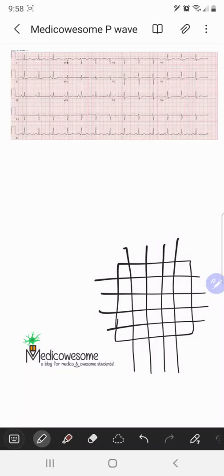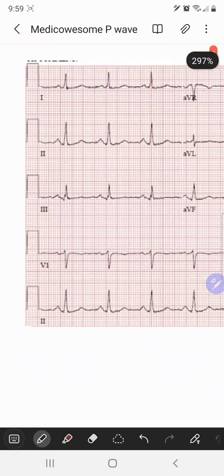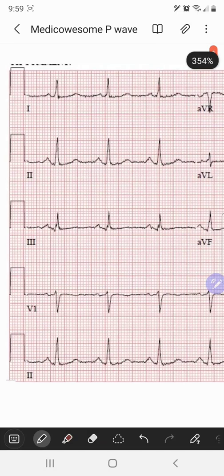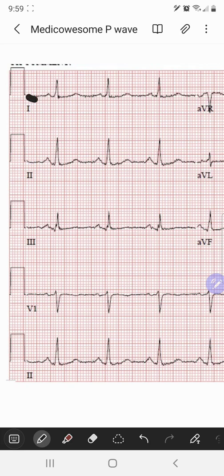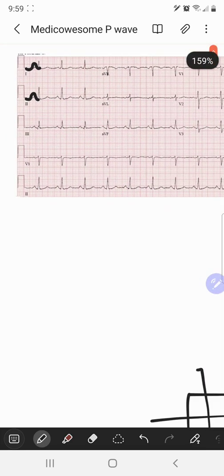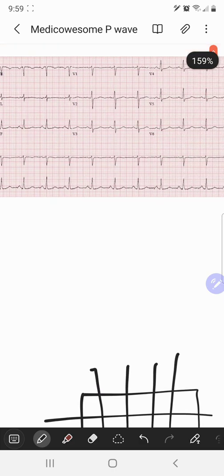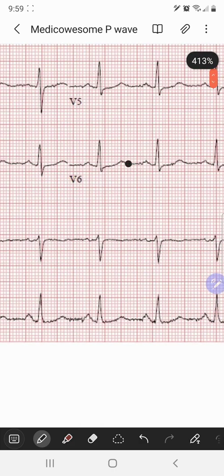In this video we'll talk about the normal P wave, which originates from the sinus node. The normal P wave usually has an upright deflection in leads 1 and 2, and it's also upright in leads V5 and V6.